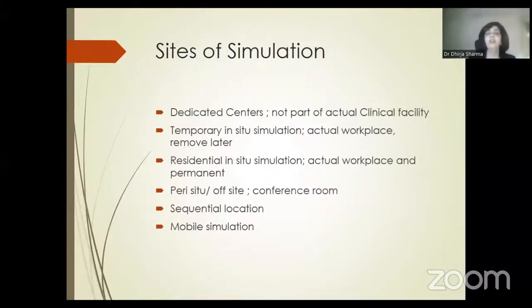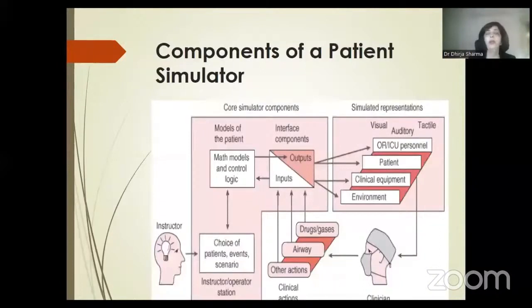In our organization, for ACLS and BLS training, quite often the trainers and the mannequins move from one center to the other. So the advantage is that we need to have a smaller infrastructure and it can be used by many trainees. What are the components of a patient simulator?